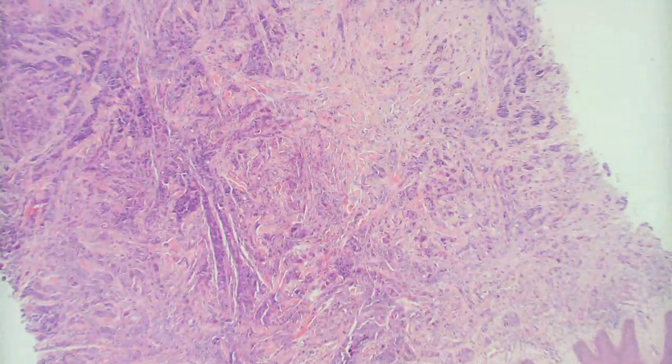I don't see any regularity. Inflammatory or neoplastic mostly? I'm thinking neoplastic. Yeah, you're thinking right. Hooray. Can you tell anything about whether it's benign or malignant?